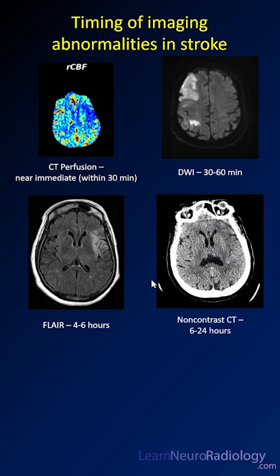There are corresponding abnormalities on CT in about that same time frame. It's a little bit less sensitive than MR, but here you can see that same patient with loss of gray-white differentiation in the insula and a little bit of swelling there.